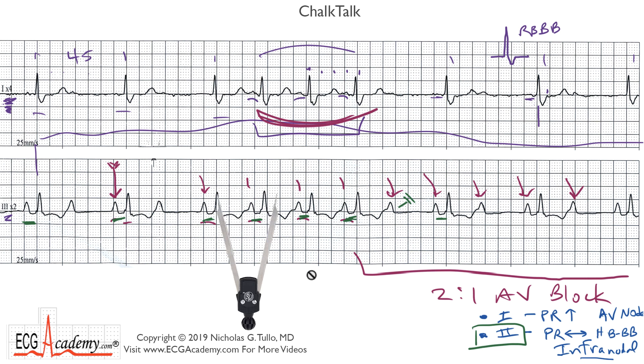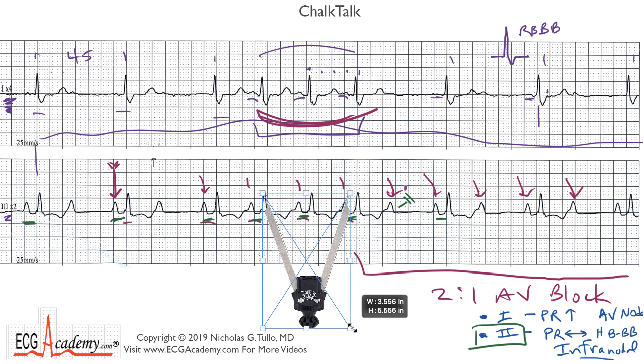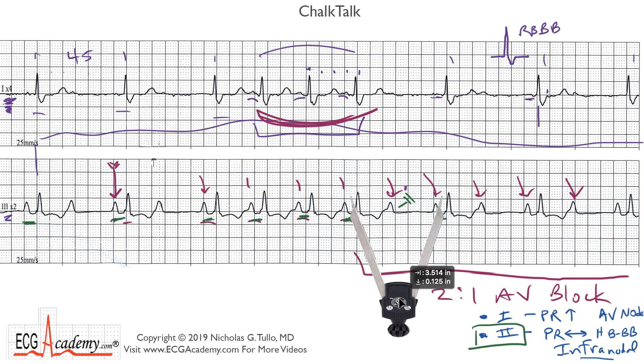One way to verify that this is type two second-degree AV block is that the pause should be exactly two times the previous R-to-R interval — because the P-to-P is regular, the next P occurs on time, and with no change in the PR interval, the QRS should be on time. I'll take a pair of calipers and resize them to equal the R-to-R interval. As you can see, that equals the P-to-P interval, and moving across, the P-to-P interval is perfectly regular. When we look at the R-to-R interval across the pause — measuring two R-to-R intervals — the R-to-R interval following the pause is exactly on time.